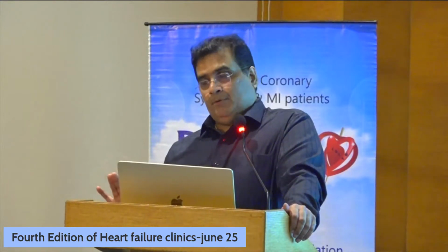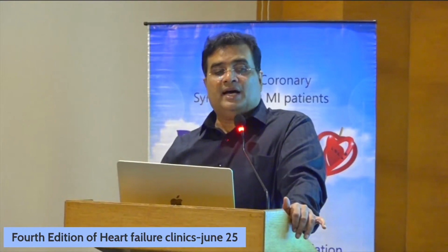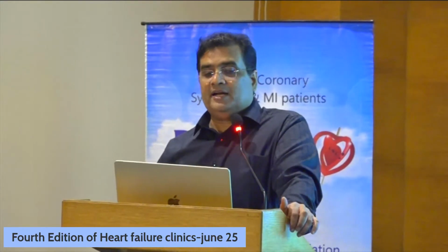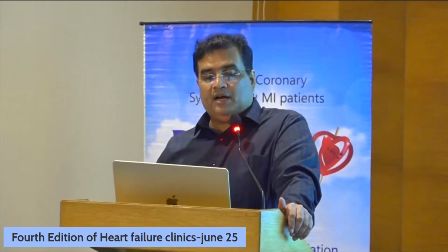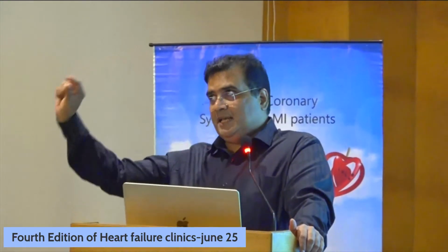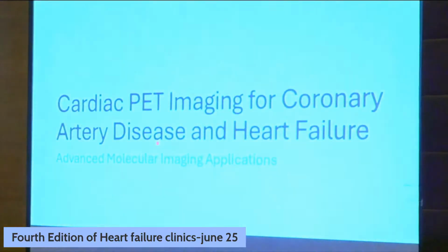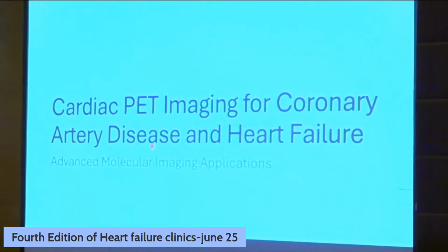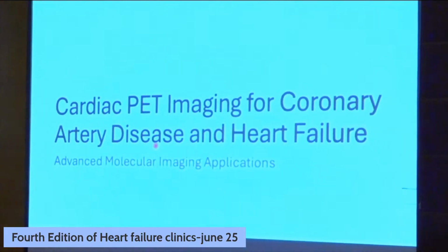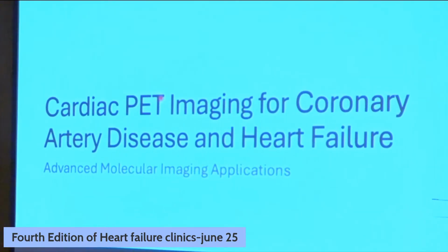Now we have discussed echo, we have discussed CT. Now we are going to the other advanced modality, cardiac PET. Cardiac PET gives molecular imaging. Coronary angiography is epicardial, whereas PET gives molecular imaging. Previously, we used to do a SPECT. SPECT means with a gamma camera. PET means with a PET CT scan. So PET is the contemporary way.